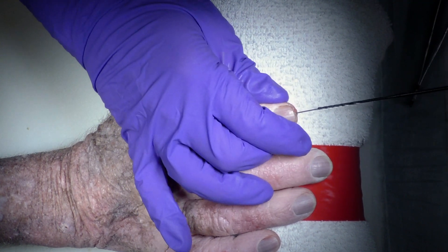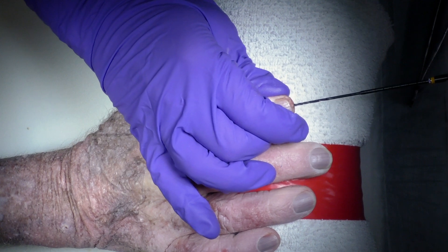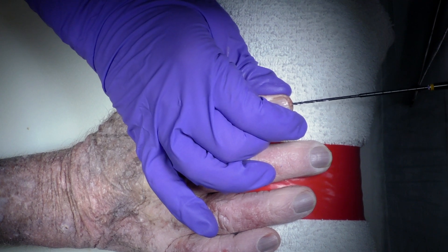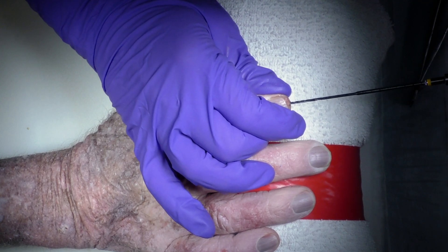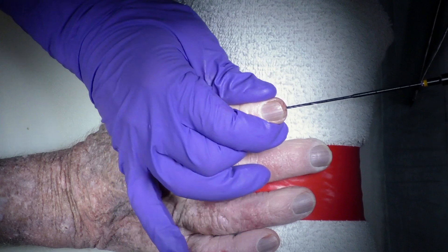Using the cannulated drill, we can drill over the guide pin. The drill has markings on it to indicate depth, so you want to go through the distal phalanx, across the IP joint, and into the middle phalanx with the drill. This drilling can be done either by hand or on power, and once you have drilled to the appropriate depth across all of the cortices, we'll remove the drill.